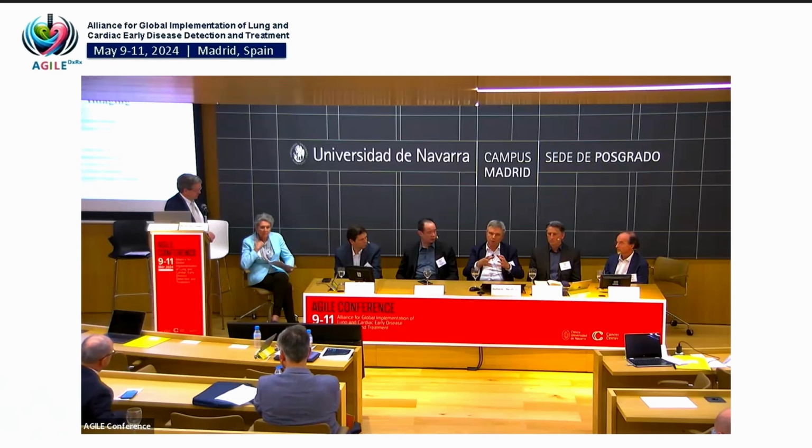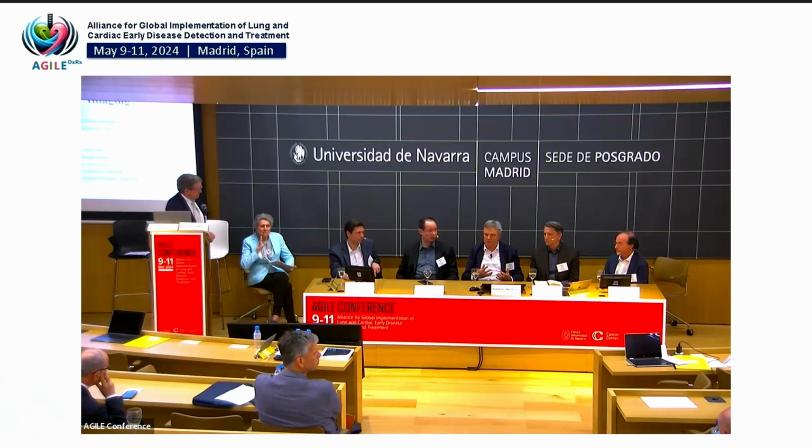And then you see that there is no further research anymore, because if you want to do histology, the lung is out and it collapses. So there is no true state. Histology is not really a comparison. So you have a very strange situation that even if you have the resected lung with the emphysema, bullae and everything in it, you cannot compare it with the imaging. So the imaging itself is its own gold standard? Yes, more or less. So ground truth, yes.